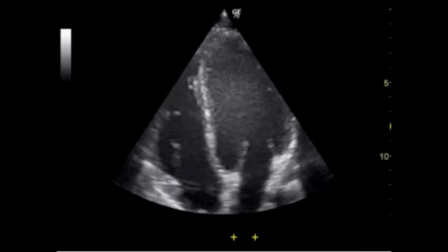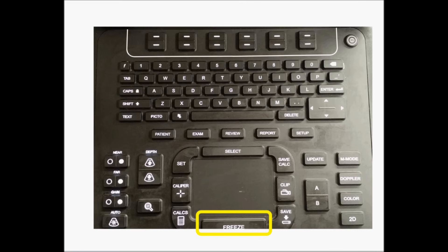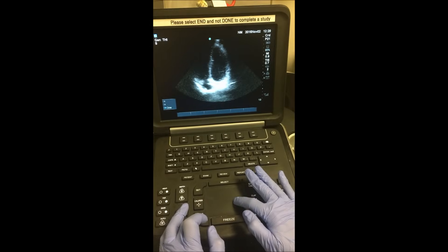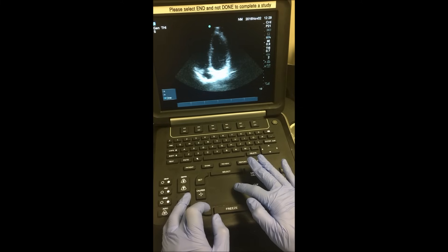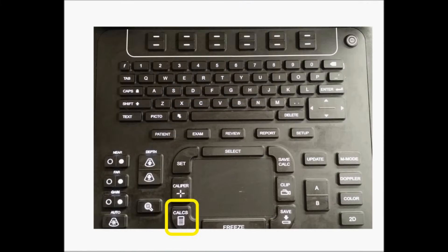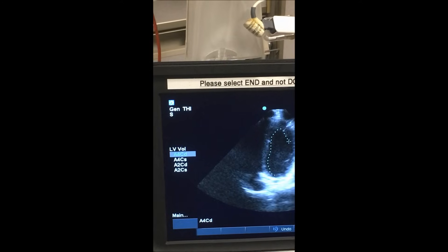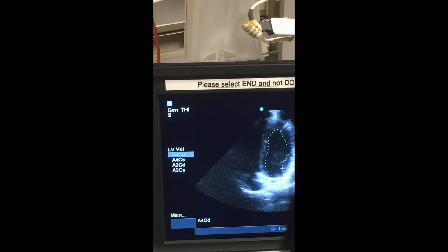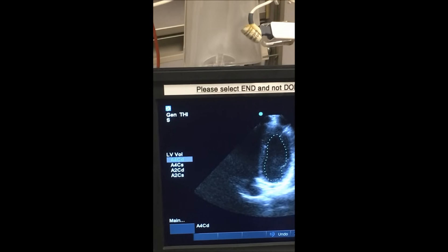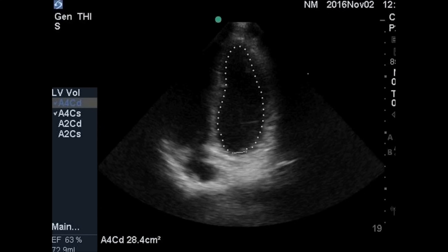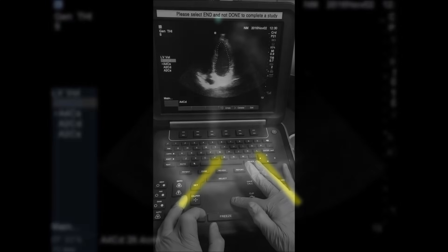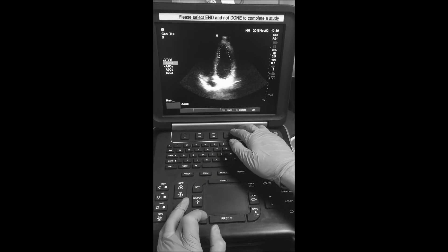Once we've obtained a satisfactory apical four-chamber view, we press the freeze button and use the touchpad to scroll to end diastole, which represents maximum ventricular filling. We then press the CALC button, select left ventricular volume, and under this menu select apical four-chamber diastole. We use the touchpad to trace the interior margins of the left ventricle — pressing undo as needed — tracing from the annulus of the mitral valve around the ventricle back to the annulus. Once done, we press SELECT and save.